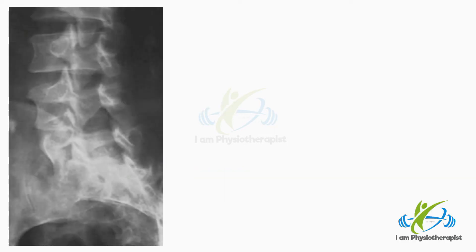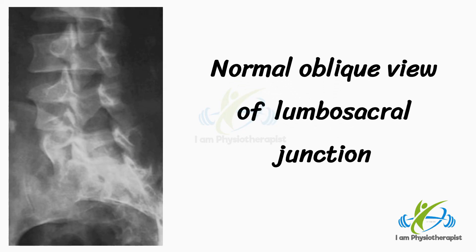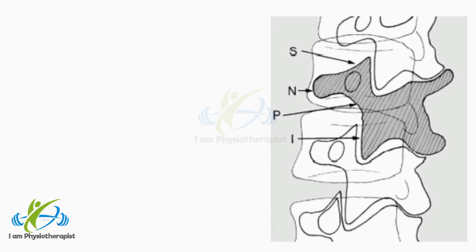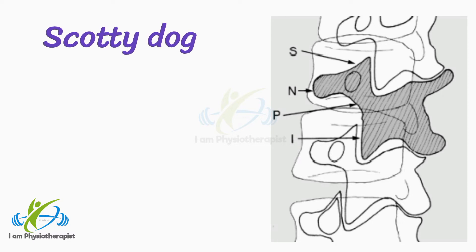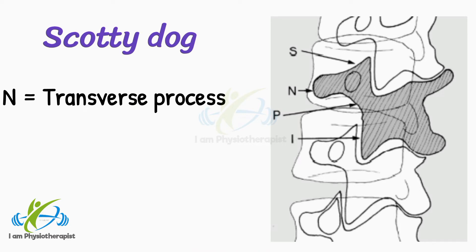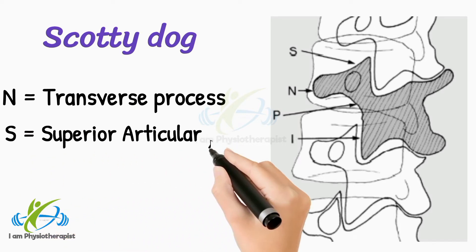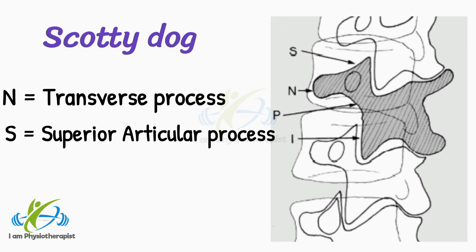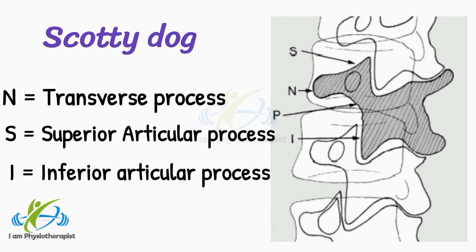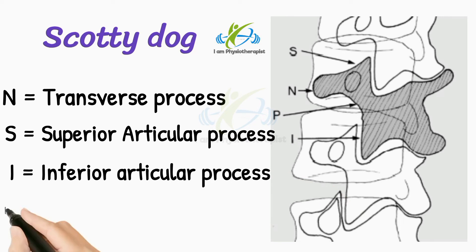This is the normal oblique view of the lumbosacral junction. In the normal oblique view, note the 'Scotty dog' shadows shown in dark grey. The nose (N) is formed by the transverse process. The ear (S) is formed by a superior articular process. The front leg (I) is formed by an inferior articular process.